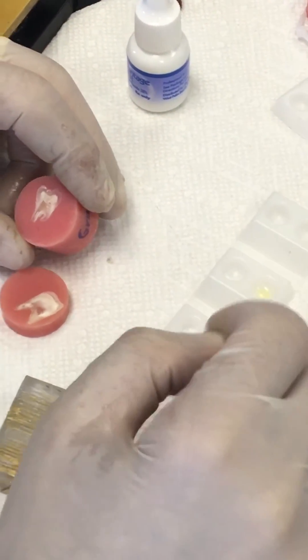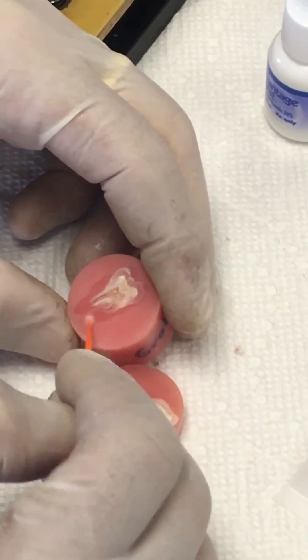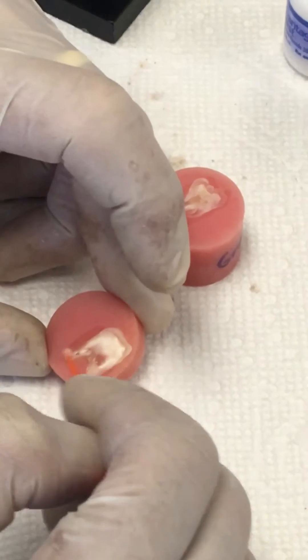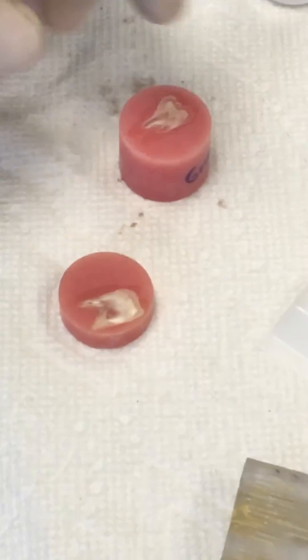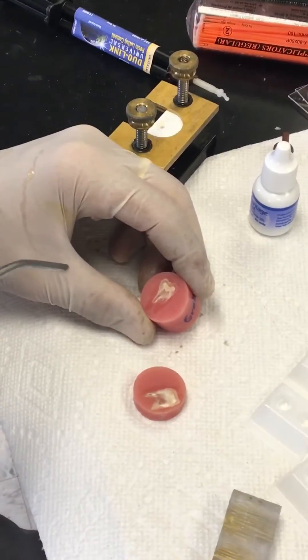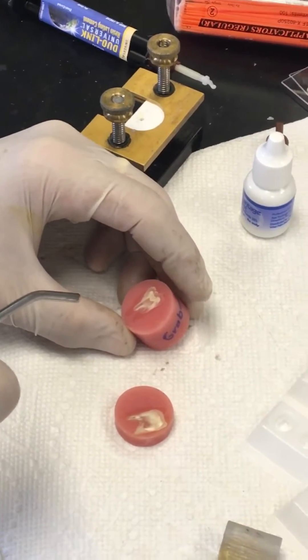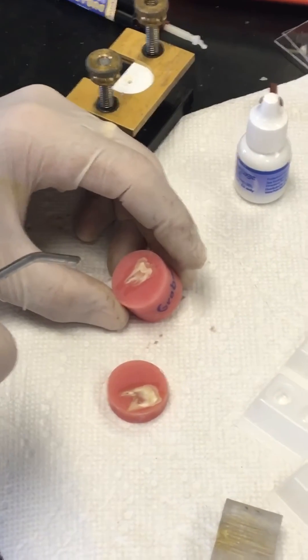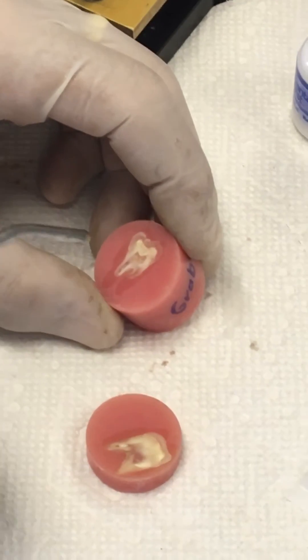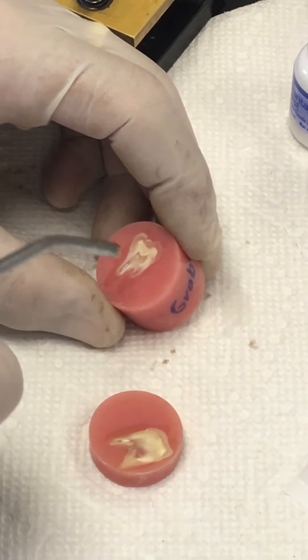I'm going to apply it on both teeth. The instructions say apply it and then dry it — to evaporate the solvent. So I'm going to dry it from far away so I don't just remove all the product from the tooth surface. I'm making sure I dry it all off. I'm doing full evaporation — not the whole 'wait until there is no movement' kind of thing, just full evaporation right there.